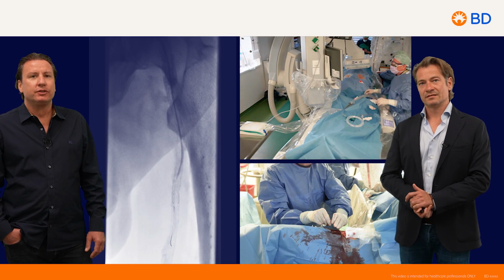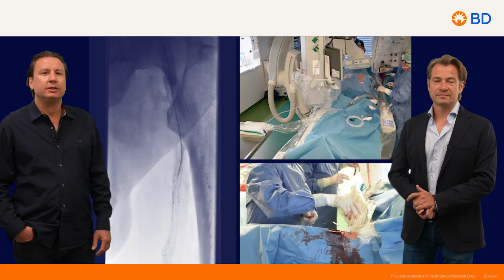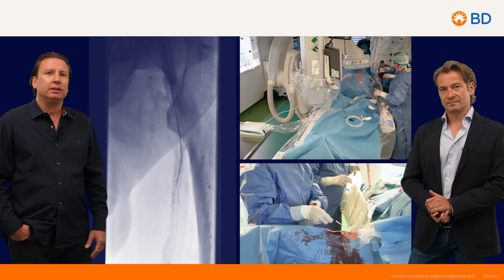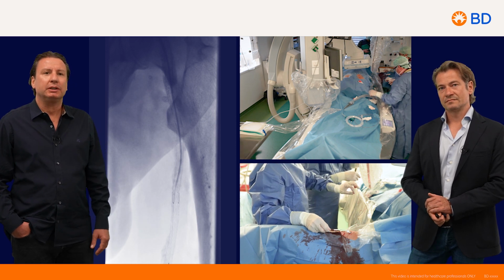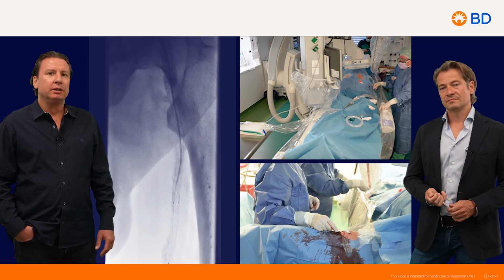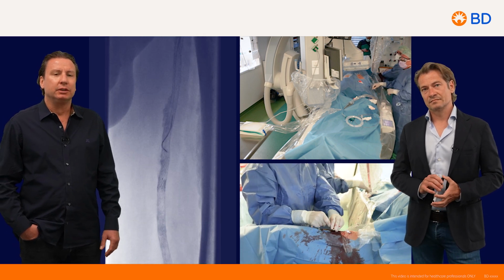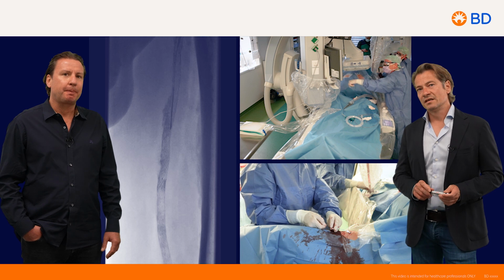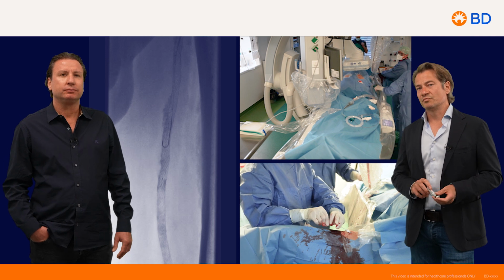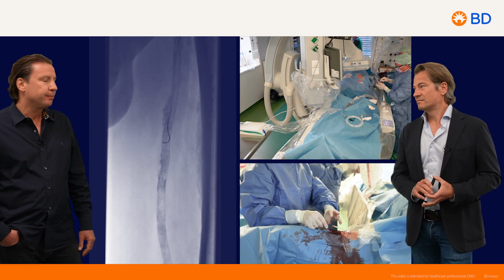And again here, this is the wire passage of the in-stent stenosis. Our standard guide wire here, as we intend whenever possible to use a debulking device, is the Command 18 standard tip guide wire, which is some kind of workhorse for me to treat this kind of lesions. But I believe that this is maybe the Rotarex wire, but at the end we had difficulties to pass, and you can exchange for every other wire.